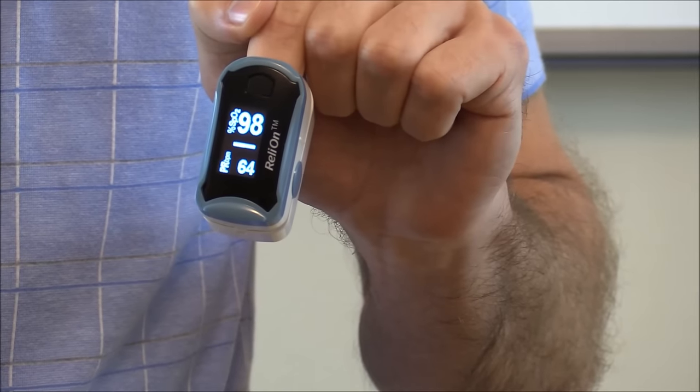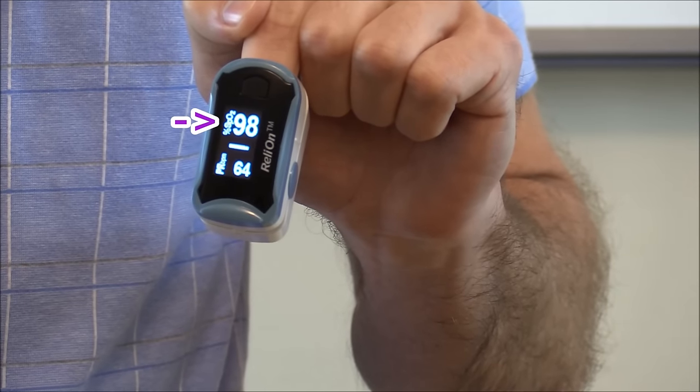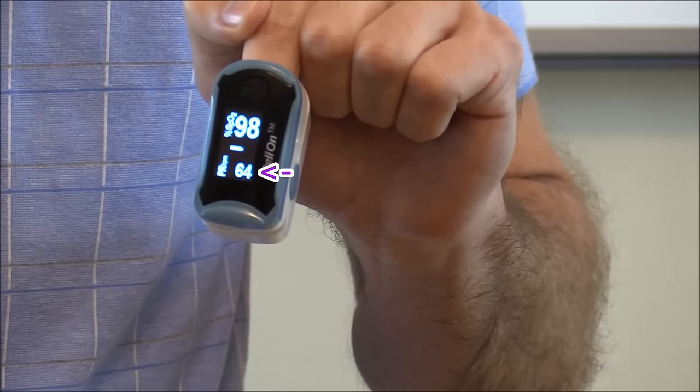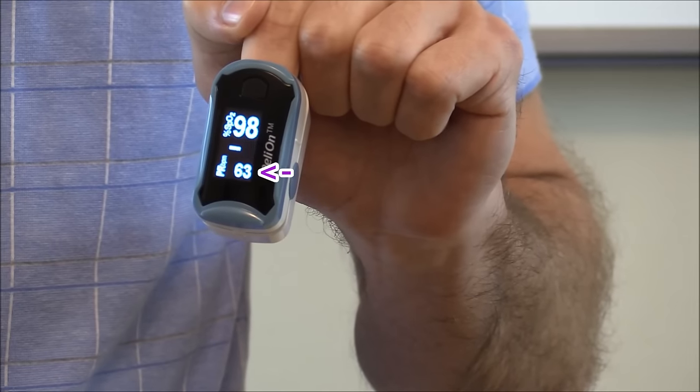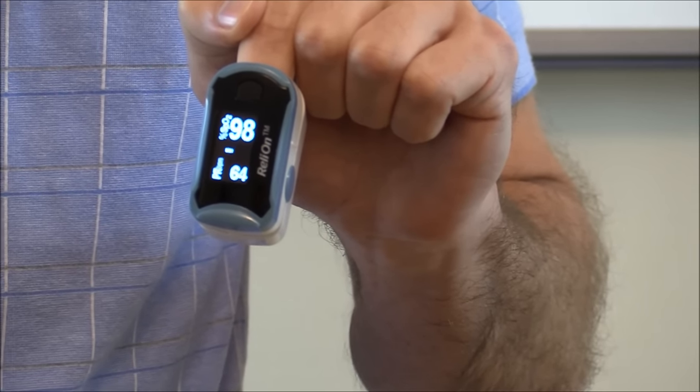Put this on the index finger of the nail bed and then just look for the reading. Here you can see that his oxygen saturation is 98%, that is the reading on the top read as SpO2, and on the bottom you will see his heart rate which is 64 but in a second I'm going to show you how to actually count the heart rate using the radial artery.